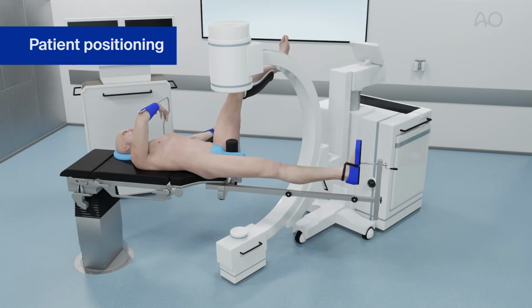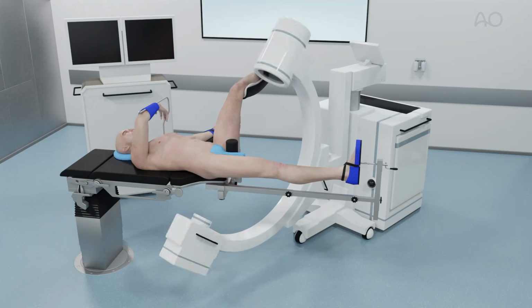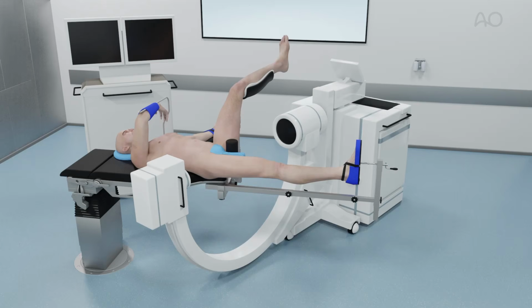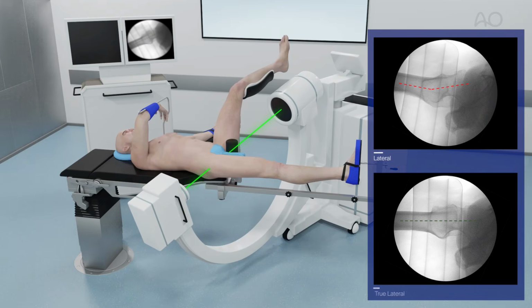The patient is positioned supine on a traction table with the non-affected leg flexed and abducted at the hip joint to allow the image intensifier access in the AP and lateral views during surgery. The anatomically true lateral view is achieved by rotating the image intensifier 10 to 15 degrees to correct for the anteversion of the femoral neck.